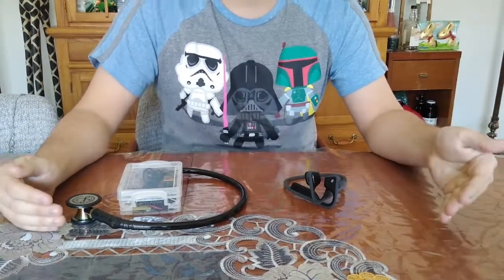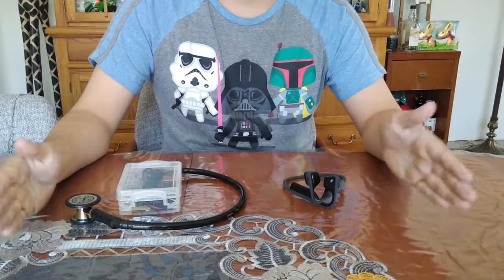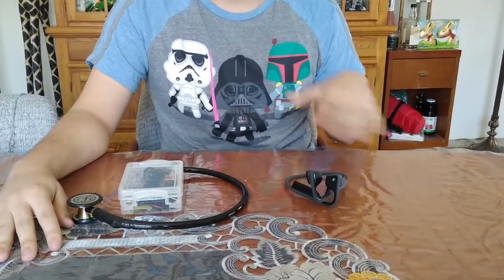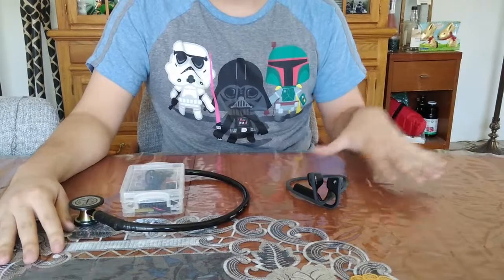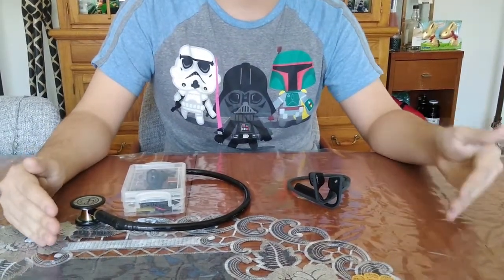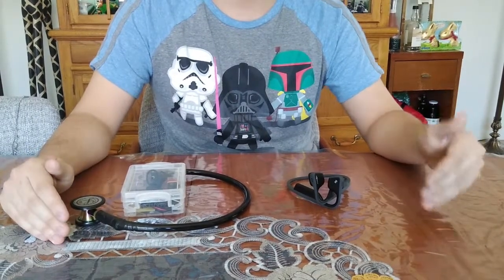So if you have certain hearing problems, like a perforated eardrum, you will still be able to hear perfectly fine with a bone conduction stethoscope. About one in five people has some sort of hearing loss, so this is very useful for a lot of different doctors, especially since stethoscopes are already so hard to hear if you don't have a very high quality and expensive stethoscope.